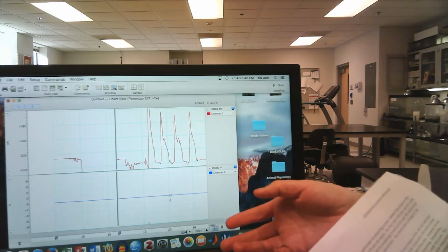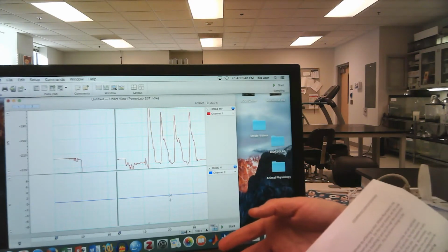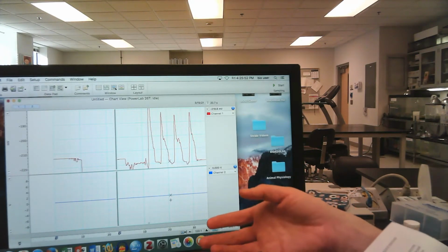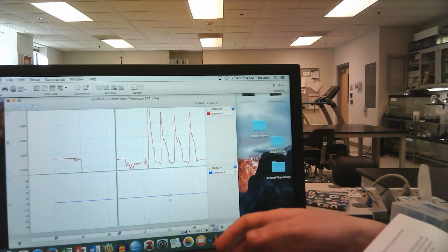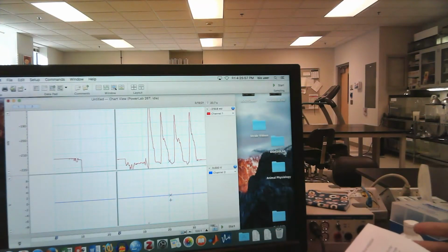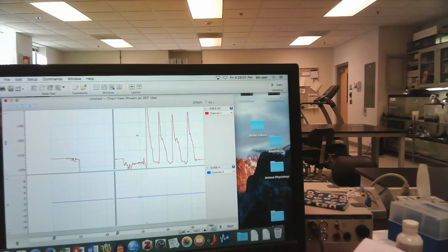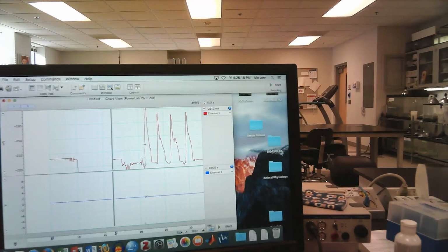So for example, if our airflow rate when we're breathing out is 1 liter per second, and the flow runs for 10 seconds, then we know the total volume is 10 liters. That's pretty easy to calculate for a constant flow rate, but from testing the spirometer, I think what you can notice here is that the flow rate changes as you're breathing, right? So you breathe out more rapidly at first, and then that tapers off as you breathe. And so how can we get our tidal volume from this type of measurement?